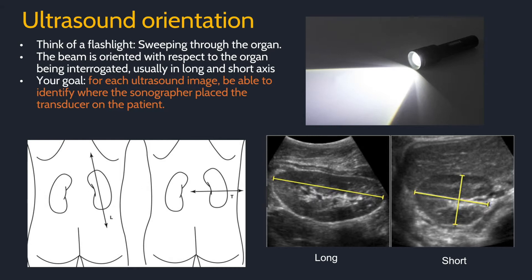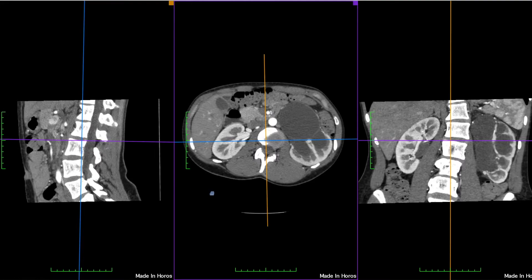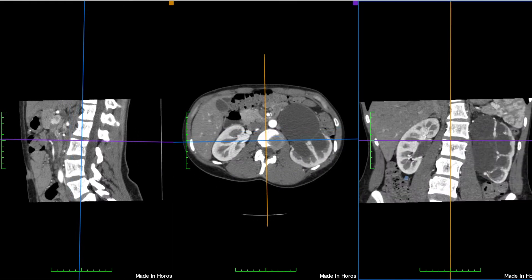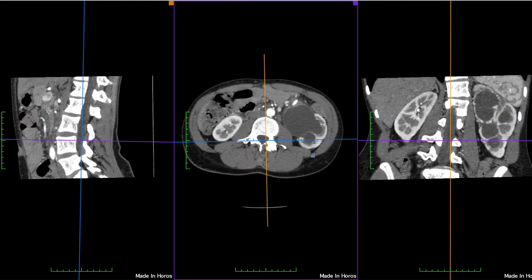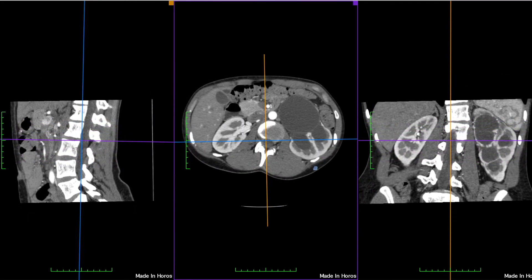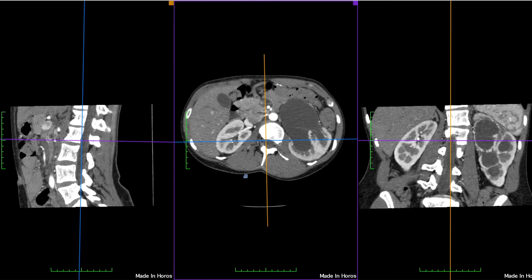Your goal for each ultrasound image you see is to roughly identify where the sonographer placed the transducer on the patient's body. Here is a CT of an abdomen in sagittal, axial, and coronal — we look through CT orthogonally. Although ultrasound can see many of the same organs, it looks at the organs differently. Ultrasound acts more like a flashlight, and we can demonstrate the difference on a multiplanar CT.